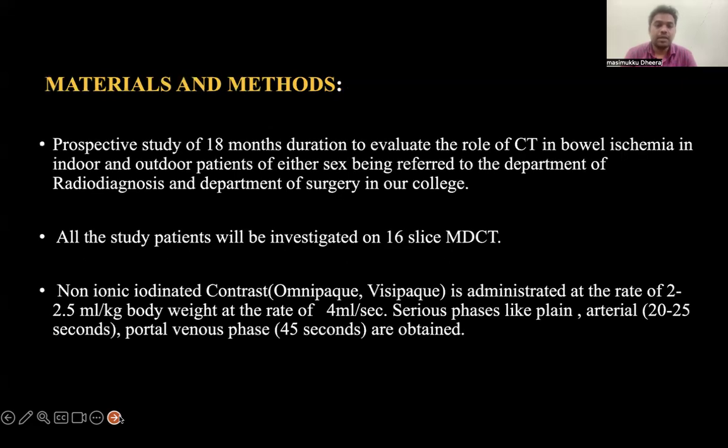Materials and methods: a prospective study of 18 months duration to evaluate the role of CT in bowel ischemia in indoor and outdoor patients of either sex, being referred to the Department of Radiodiagnosis and Department of Surgery in our college. All the study patients will be investigated on a 16-slice MDCT.